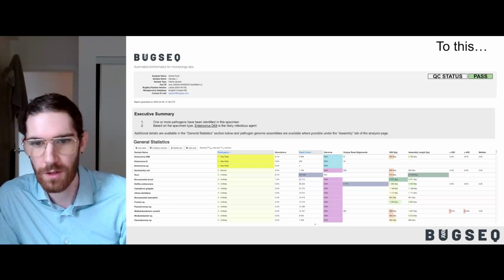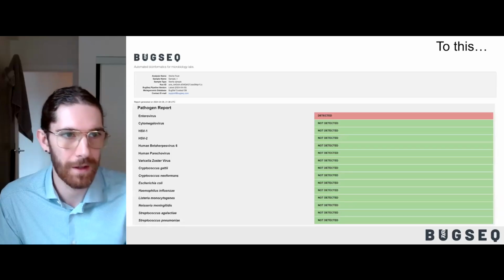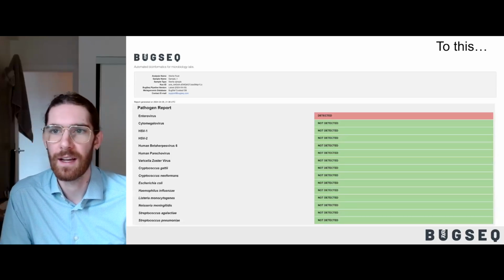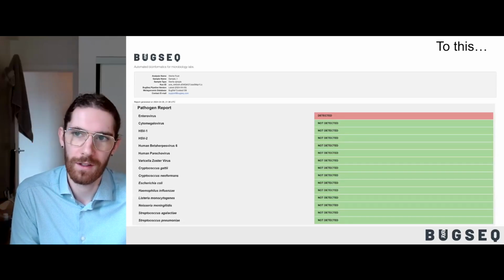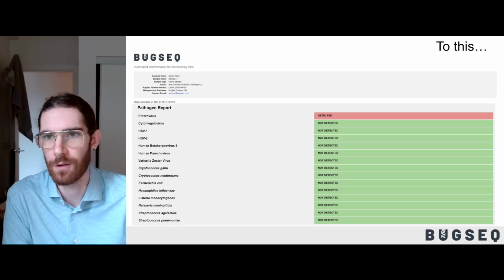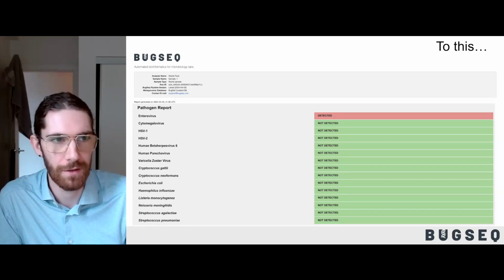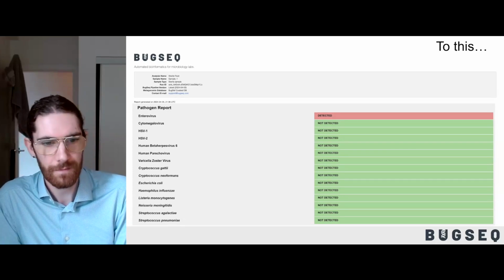And then providing a similar structured microbial listing, but then going a step further to providing outputs akin to syndromic molecular diagnostic panels in terms of which pathogens were detected or not detected within a given sample type and specifying it to that given sample type.